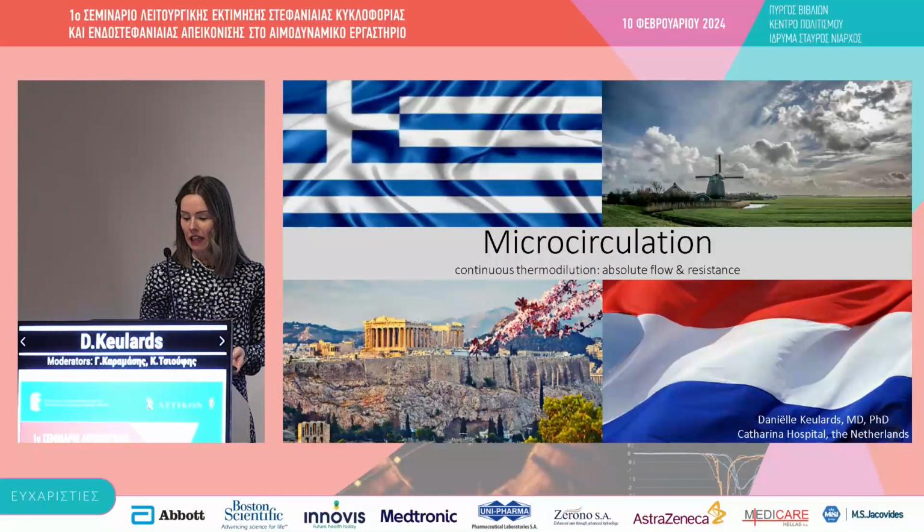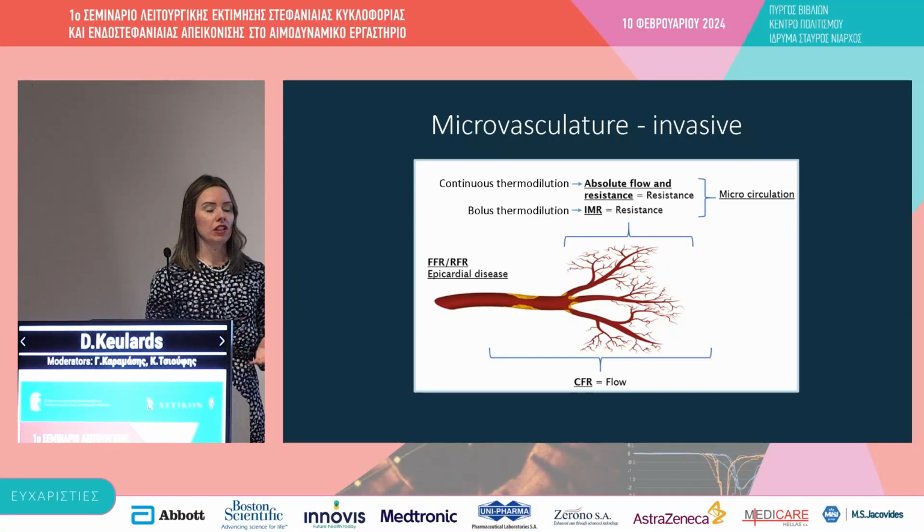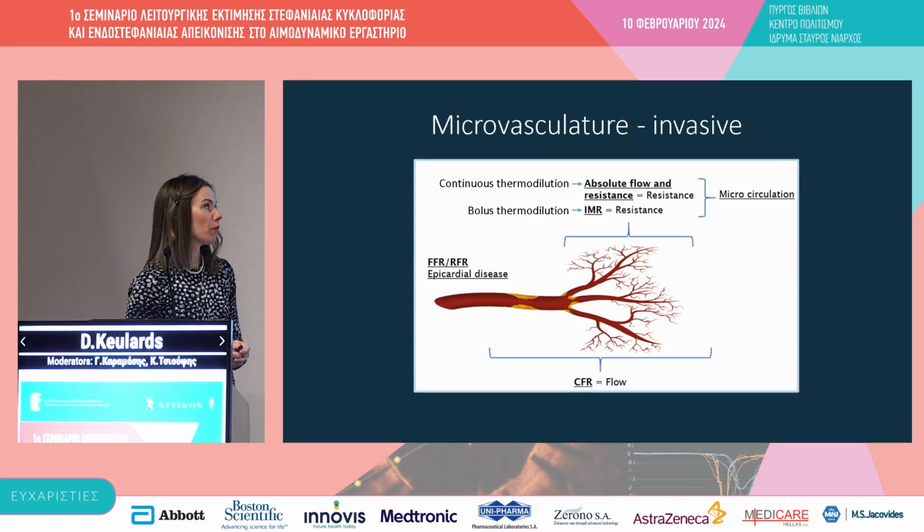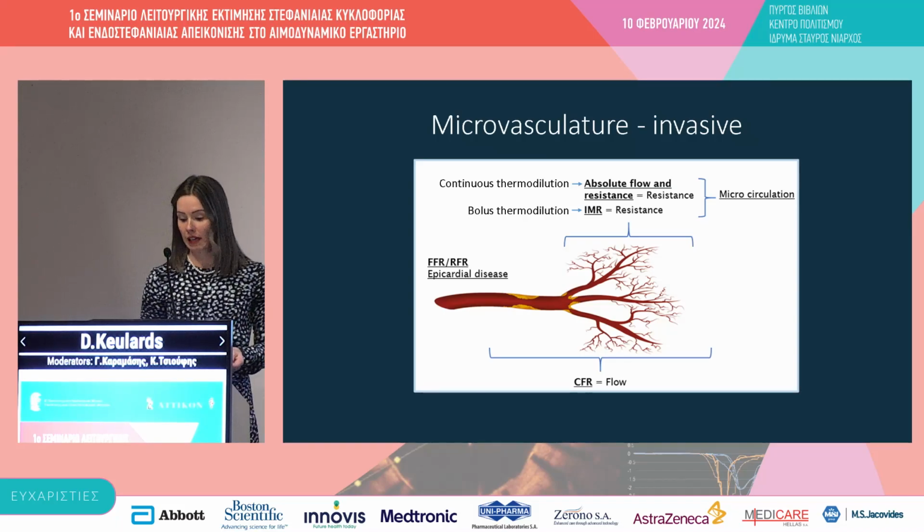I'm going to indeed talk about the continuous thermodilution, and we already heard that there are actually two methods to investigate the microcirculation more specifically. First, we already heard about the bolus thermodilution, and I'm going to explain more about the continuous thermodilution technique.